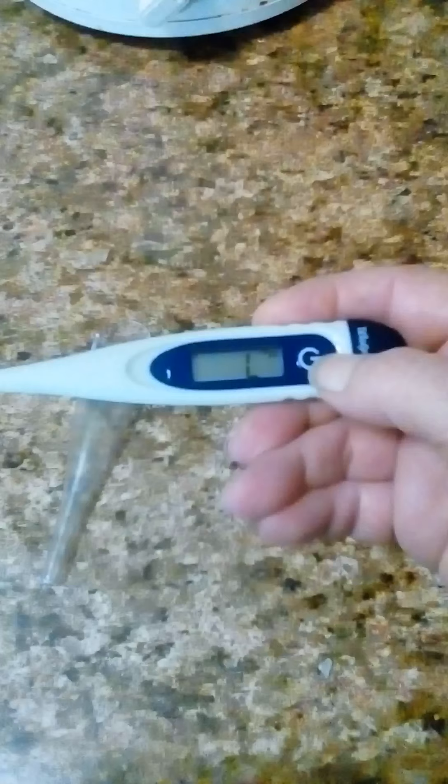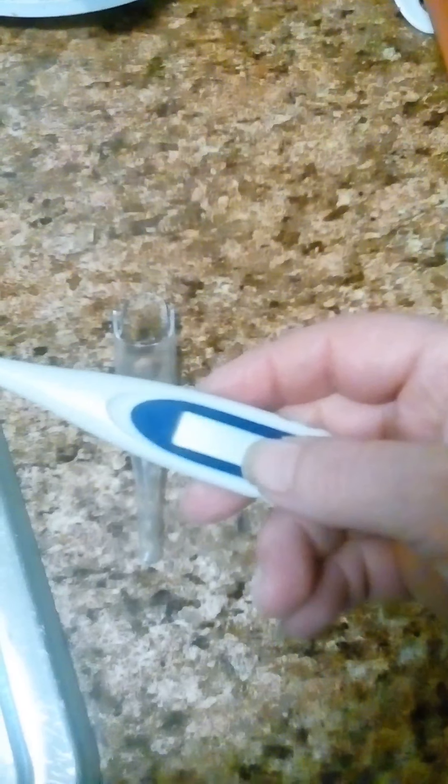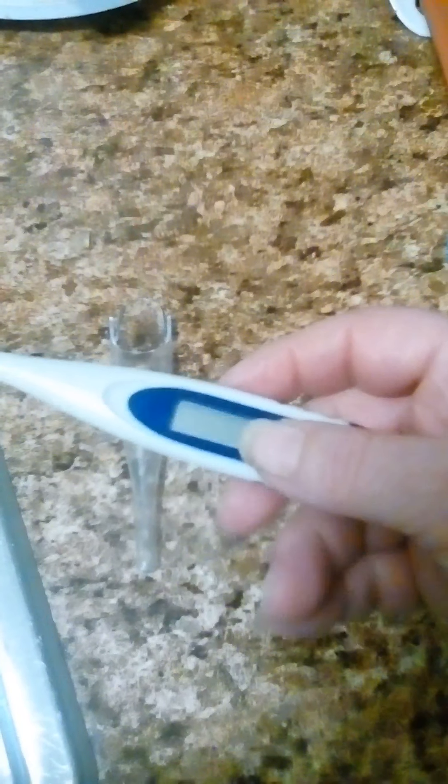It's pretty easy to use. You just point it under your tongue, and it shows you the temperature — your temperature, or whichever.